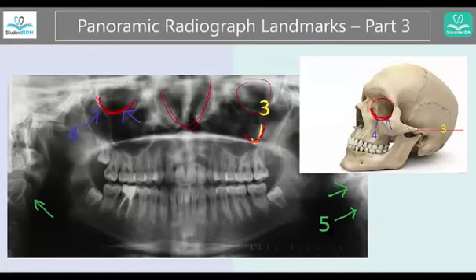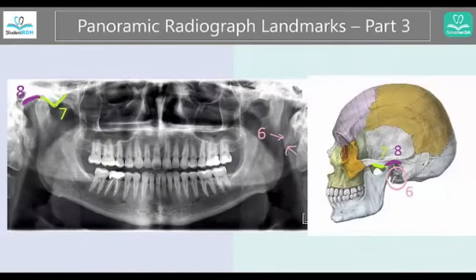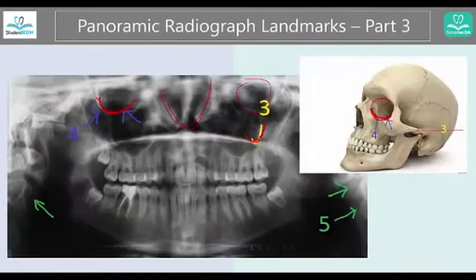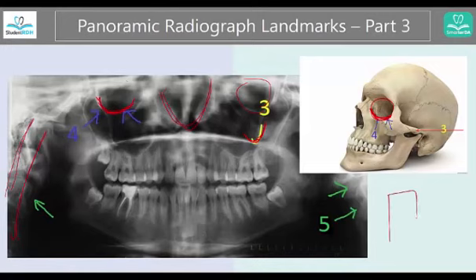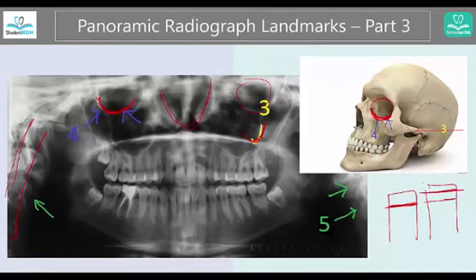Now let's look at number five, which was the spine. If the patient is curving or is biting a little too forward in your bite block — there is a notch — ask the patient to put their anterior teeth right here. Because if they are biting a little more forward like that, the spine will be in the way and it would be captured on both sides. So this area is fine.